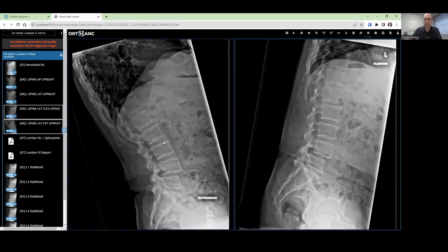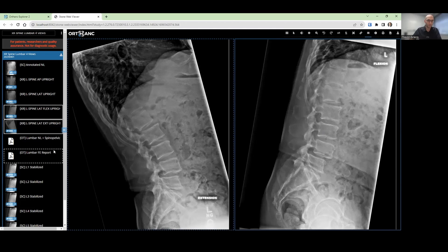This might be how we typically look at it — we have extension on one side, flexion on the other. We can see this patient has spondylolisthesis at L4-L5. We might be asking ourselves if this is mobile. Traditionally, we might use line drawings and take measurements, but with SpineCamp, there's no need to do that.